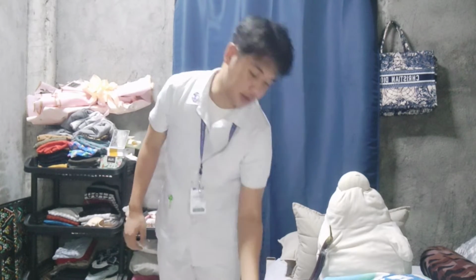So we need to check the medication every time. So we need to follow the 3 checks for administering the medication. The first one is we need to read again the medication: when it is taken from the medication card, before withdrawing the medication, and after withdrawing the medication. The rationale of this is to ensure that the right medication to be withdrawn is also the same medication inside the packaging. So it is much more efficient to look every time.